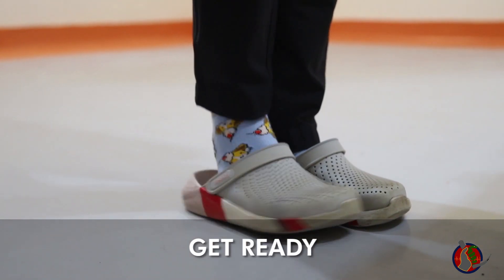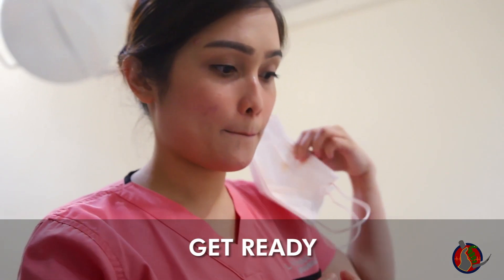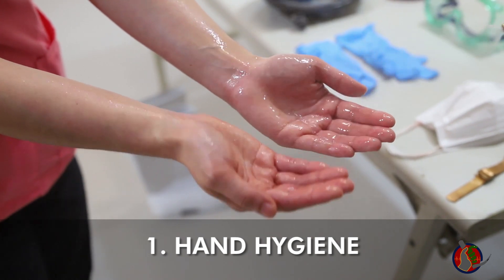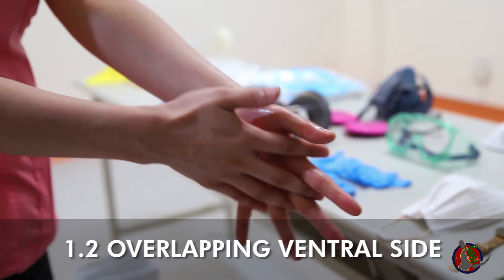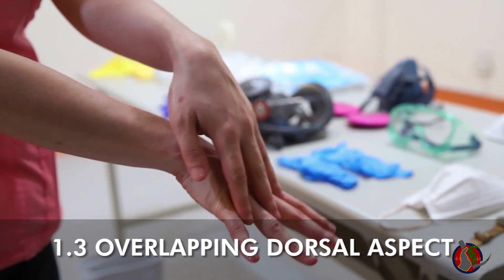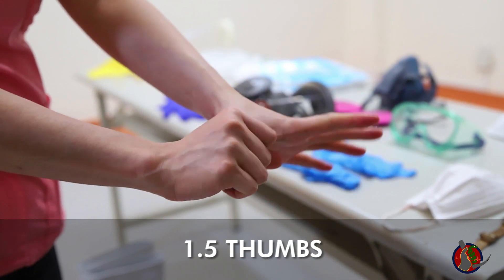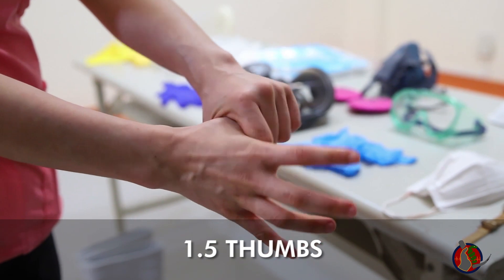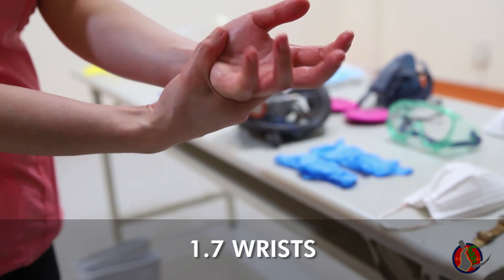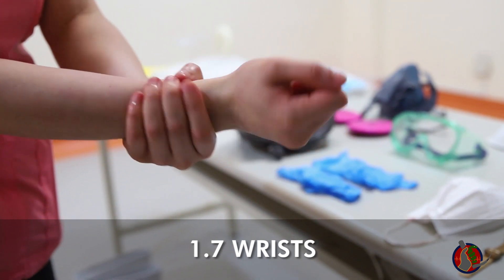Remove jewelry and watches before donning. First, alcoholize both hands carefully: palm to palm, overlapping ventral side of fingers, overlapping dorsal aspect of hands, clasp distal fingers, clasp left thumb in right hand and vice versa, circling motion in the middle of palm, then wrist. For each succeeding hand hygiene step, do all seven steps of hand hygiene.